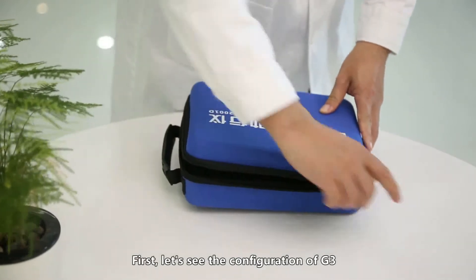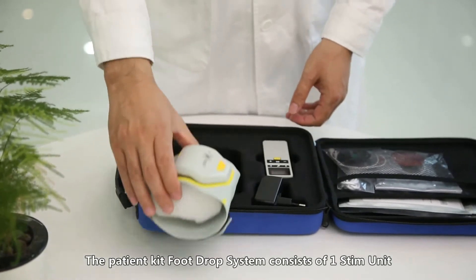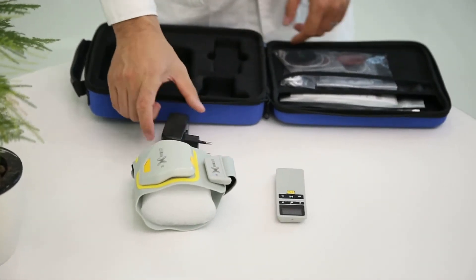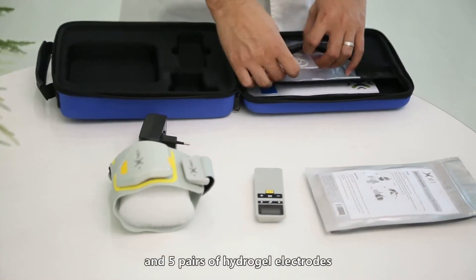First, let's see the configuration of this product. The patient kit foot drop system consists of one stim unit, one remote control, one charger, two non-woven electrodes, and five pairs of hydrogel electrodes.